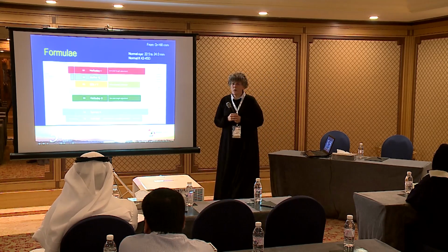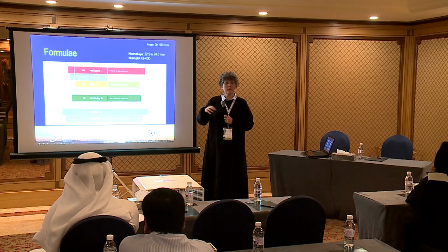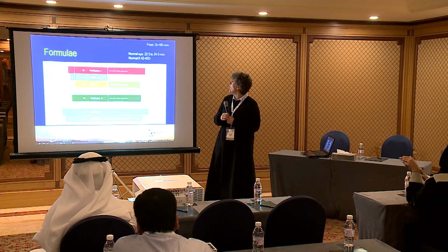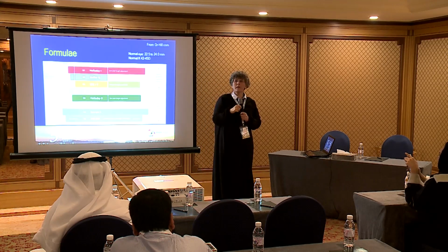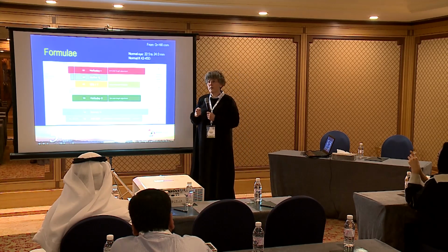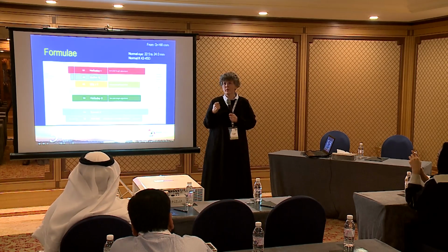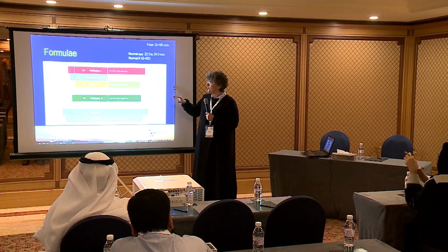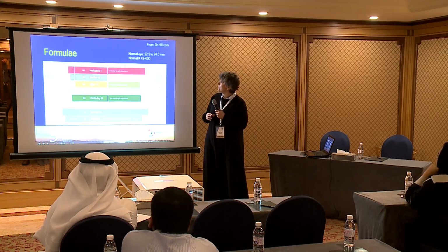So I took this, do you know the site drhill.com? Well, he has a very big site on IOL calculations, on how to do the biometry, how to get your own results better, how to do a checkup of astigmatism, your own induced astigmatism. I took this from there. And what he did is he put all the formulas in one place.